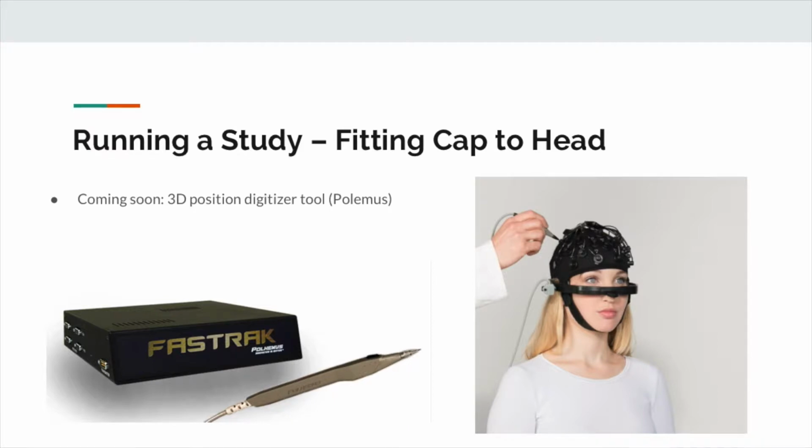We also have the system, meaning it's sitting in a box, and I haven't worked with it yet, but we have this system called a 3D position digitizer. It's a Polhemus system specifically that we have, and once you have the cap set up on someone's head, it essentially allows you to register where those major external landmarks are, and then you touch where all the optodes are positioned on the head.